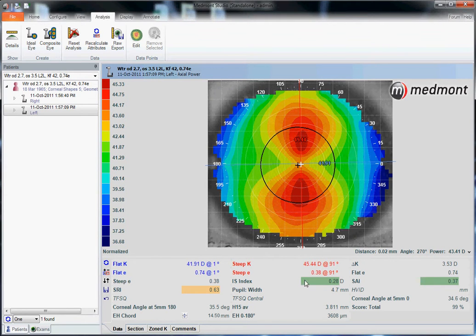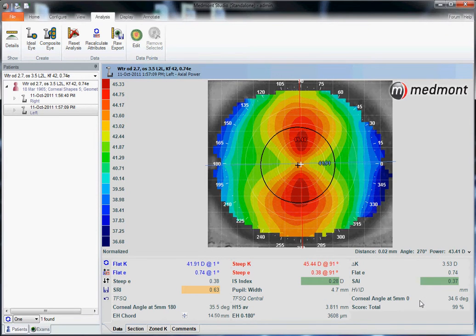Now we can see that the standard attributes are here — the K's, the eccentricity, the disease detection indices — but we also have a number of attributes that have been added by this particular user.